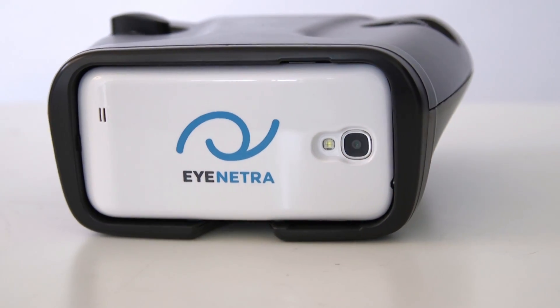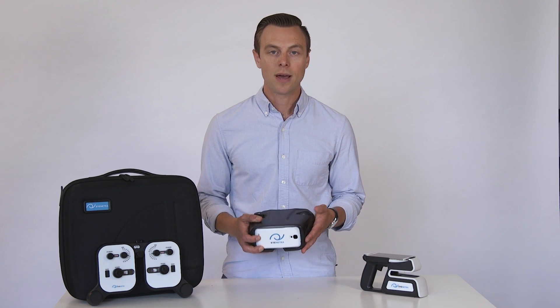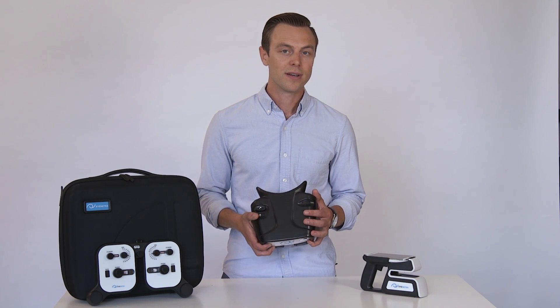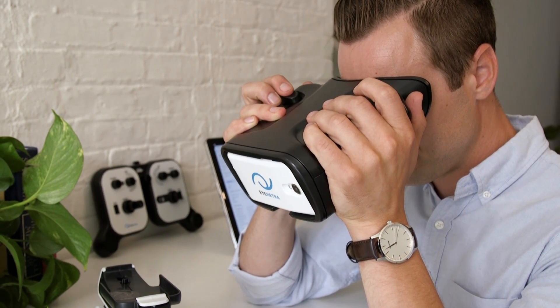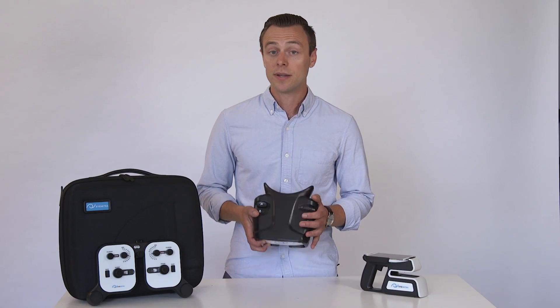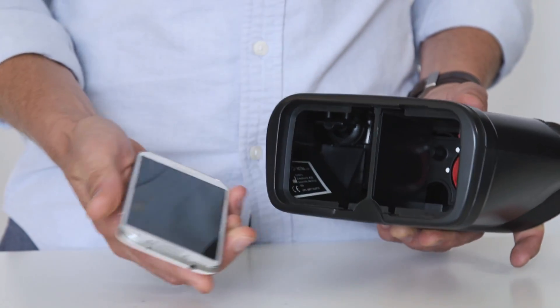The Netra autorefractor is a smartphone-powered screening tool that measures baseline refractive error. It will screen patients for myopia, hyperopia, axis of astigmatism, and calculate PD. However, unlike a traditional autorefractor, this test is subjective.